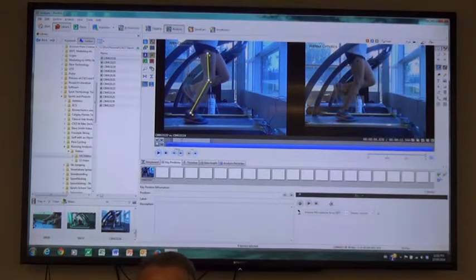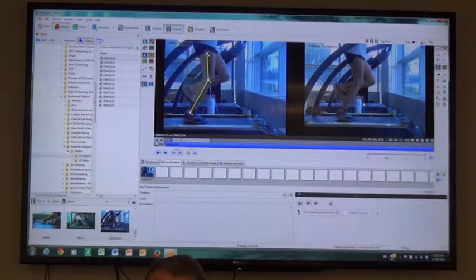So we can do the same thing with the right leg, with the without orthotics condition, and then we can do a comparison of those two. Okay, with and without orthotics.